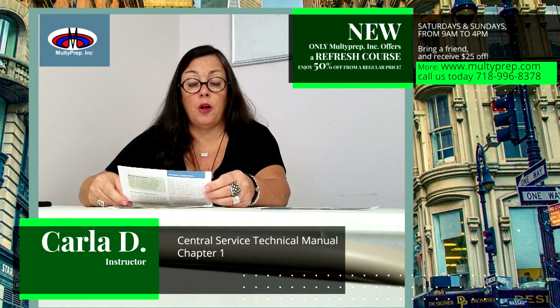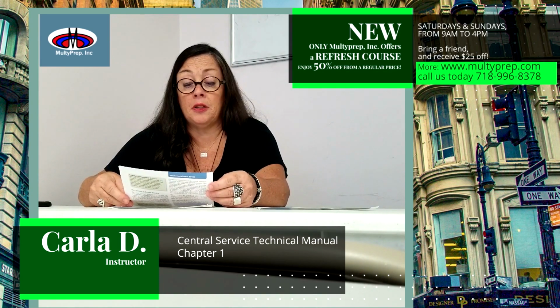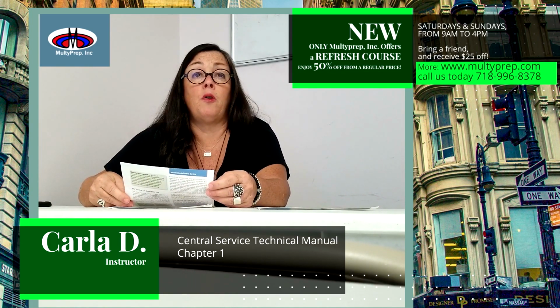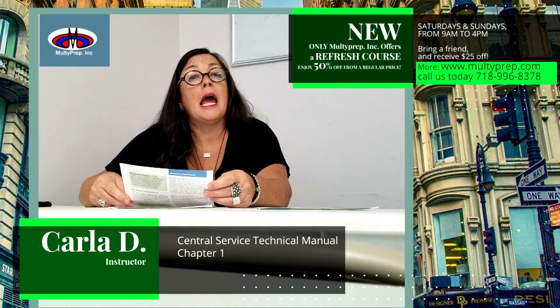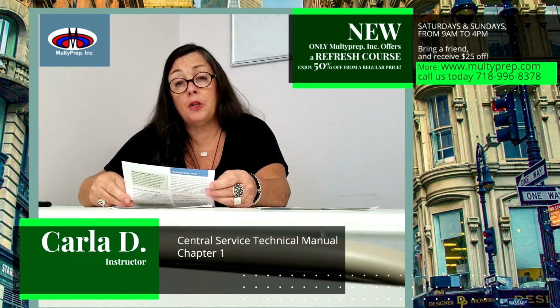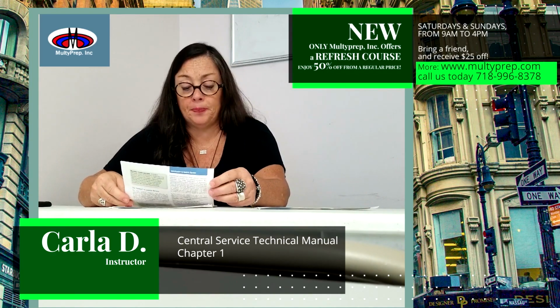Central service workflow. Because the Central Service Department is the central location for delivery of soiled, used medical devices and the distribution of clean and sterile items, proper workflow is important to help ensure safety. Soiled materials must be isolated from their clean counterparts to ensure acceptable processing conditions. A one-way flow of materials from the soiled area to the clean processing area and onto sterile storage is required.